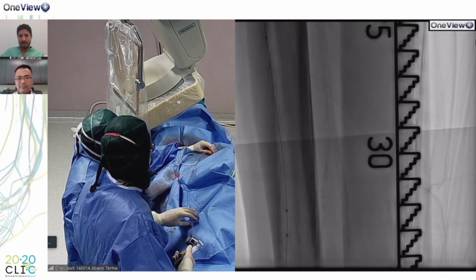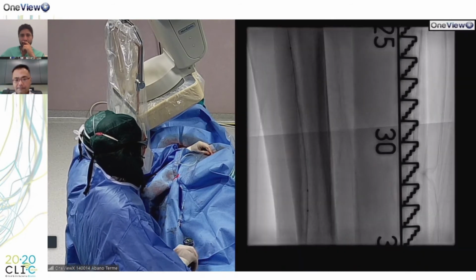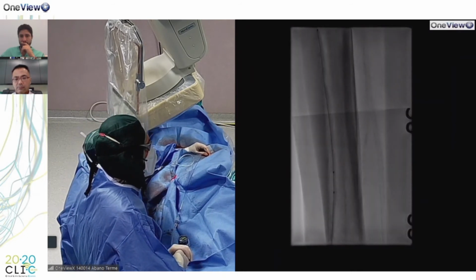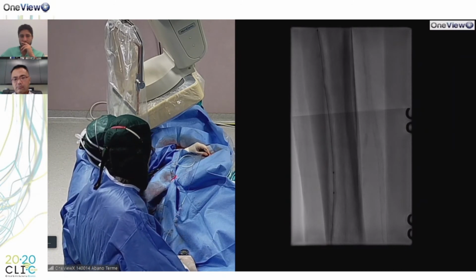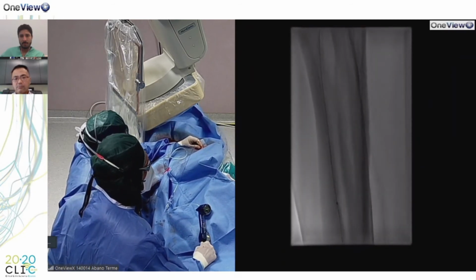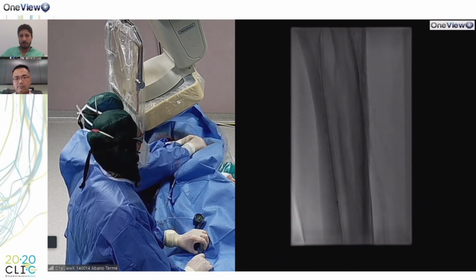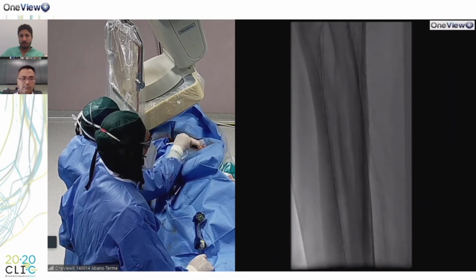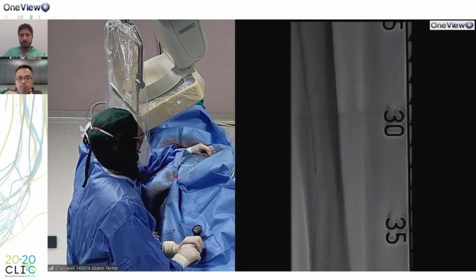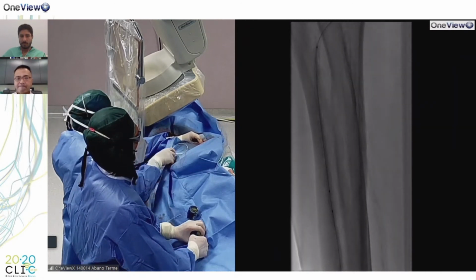Now we have another jade. This is 2 millimeter, and it is 180 in length. Okay. We are now at 18 and 20 atmospheres. Okay, and okay, deflate. Again. Okay, we remove the balloon, deflate.